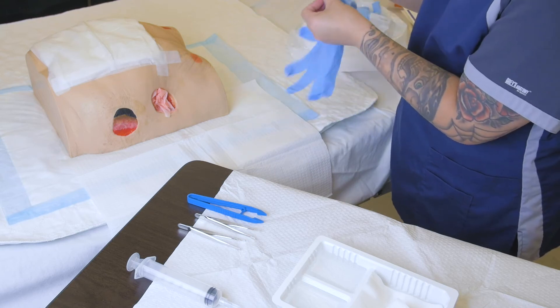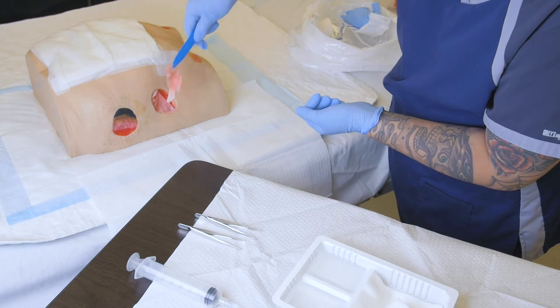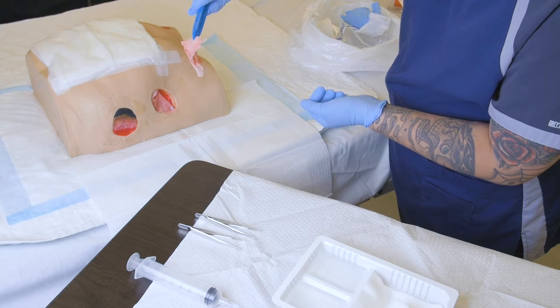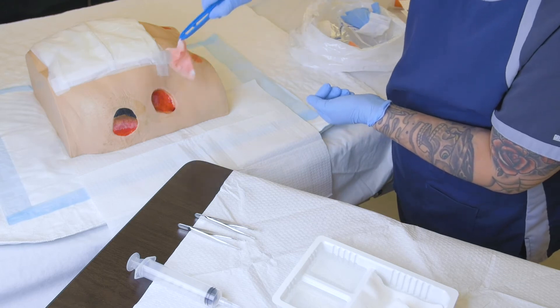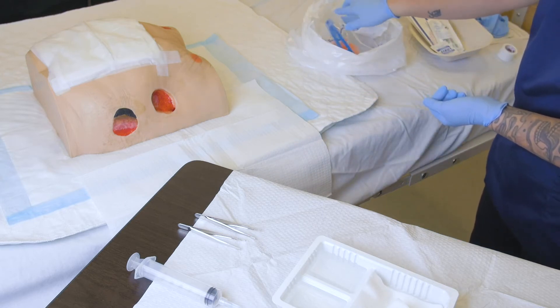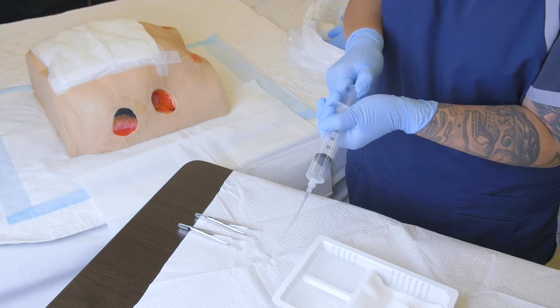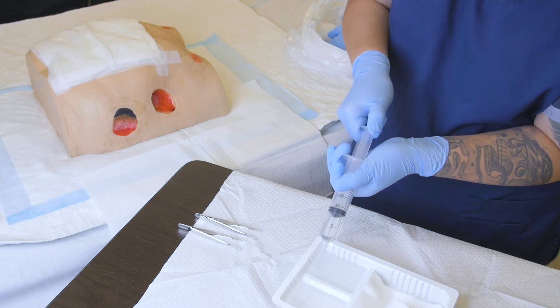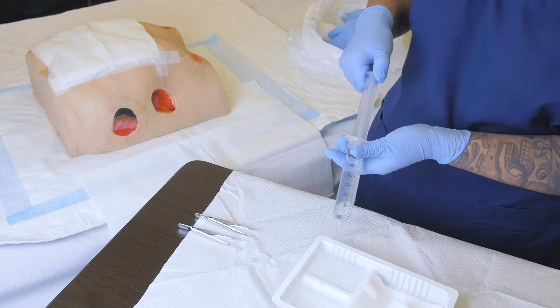We take our blue forcep and remove the packing, taking note of the amount and type of exudate — this one is saturated with sero-sanguineous exudate. We also want to make sure we count how much packing we're taking out and compare it to the previous documentation if there is any. Here we've taken out two pieces. We discard the blue forcep as well since we no longer need it. Now we are going to irrigate our wound with 60 to 120 cc's of normal saline.